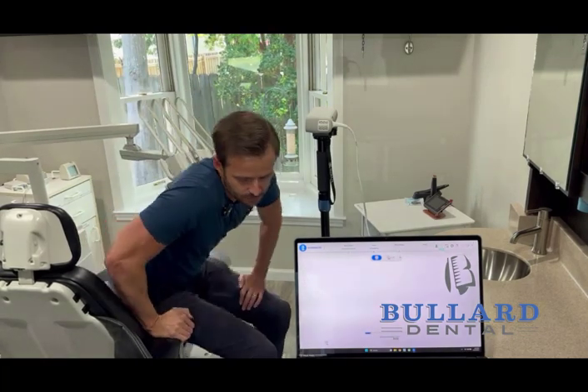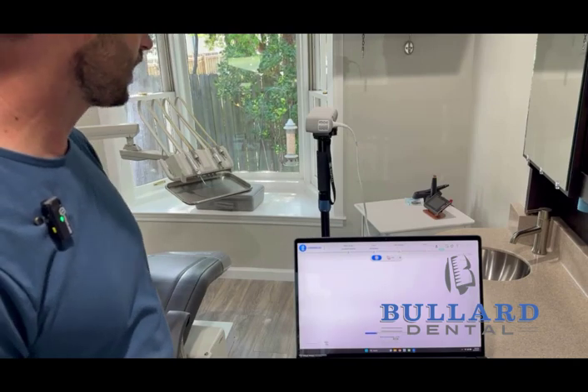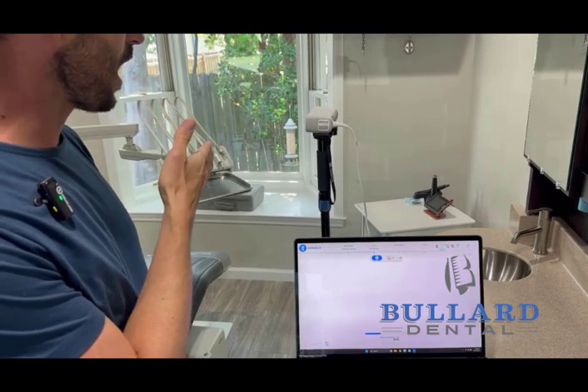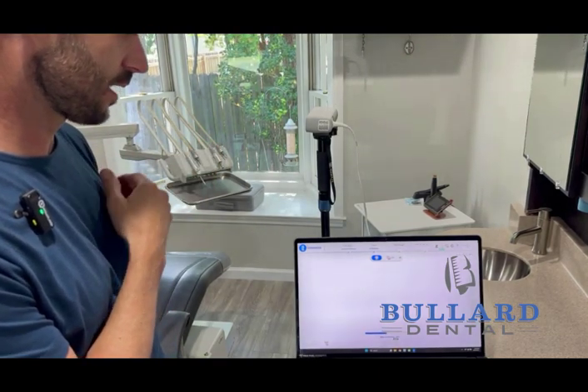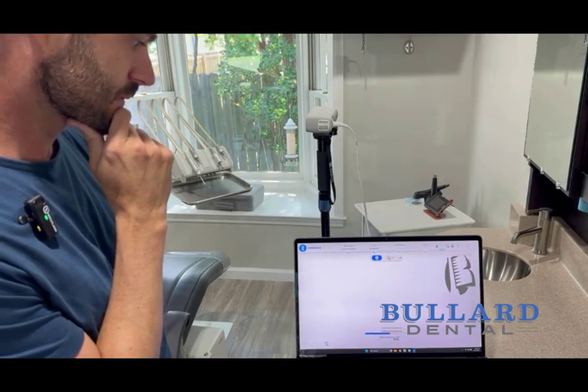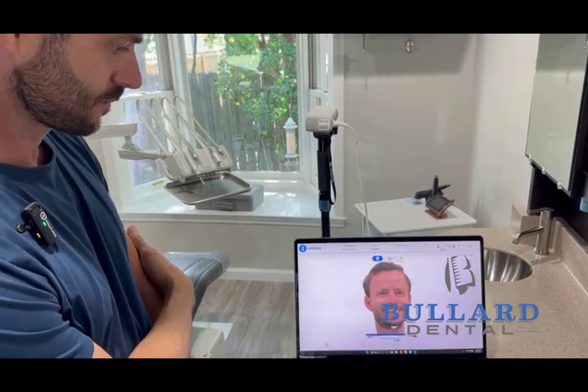We go ahead and start scanning: look straight, look to your left, back to center, then to your right, and back to center. That finishes the scan. It's a fairly quick process compared to some other facial scanners on the market. You have the option to hold it in your hand, but leaving it in place seems to be pretty accurate.